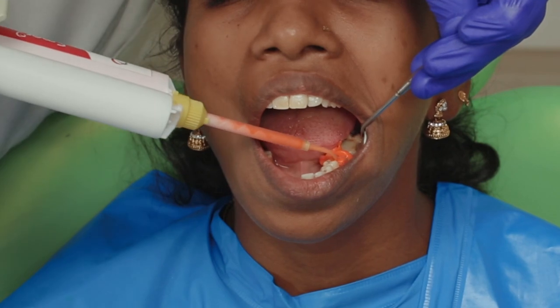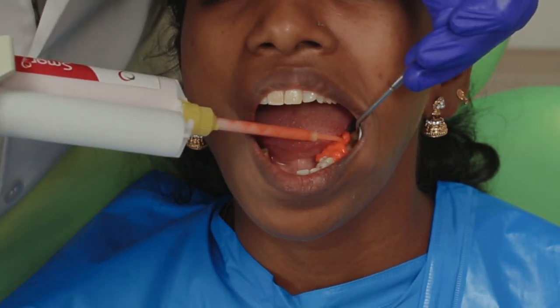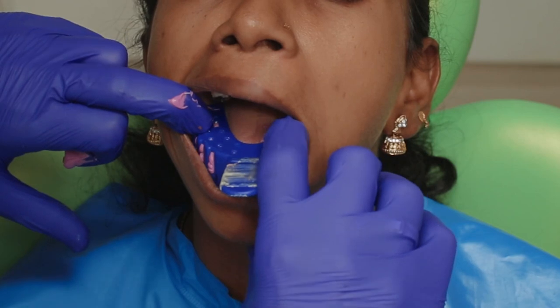It is very important to have the light body in critical areas, especially the margin. My tray with the heavy body then goes in and I wait for it to set.